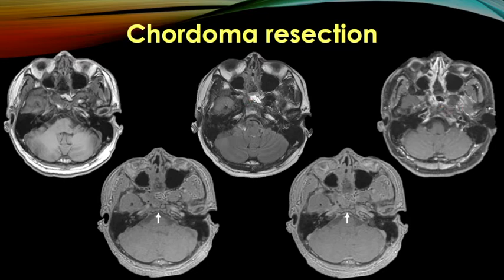And here we actually have a pre-contrast and a post-contrast ZTE. You can see that the proton density weighting, because it's such a rapid acquisition, is quite stable between the pre and post exams. You do get a little bit of marrow enhancement and vascular detail, but you can actually perform this sequence either way, and it gives a very nice example of the remaining bone stock at the skull base.